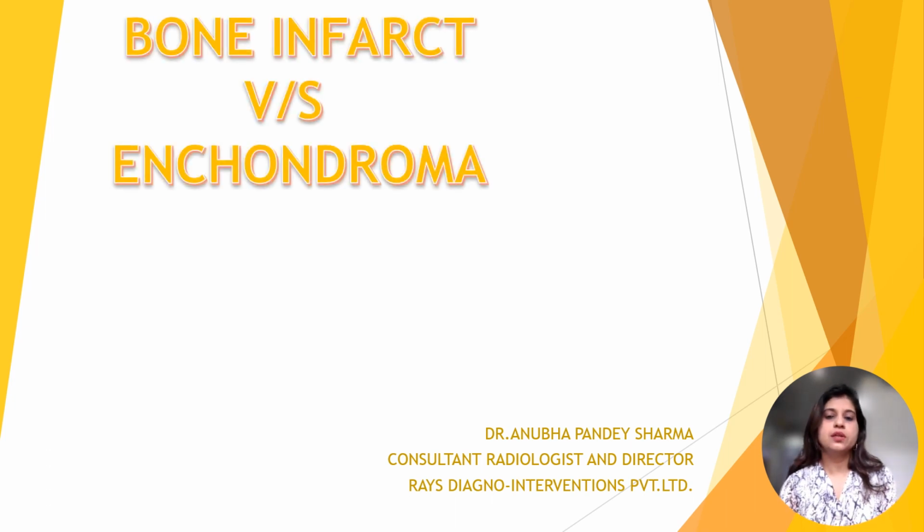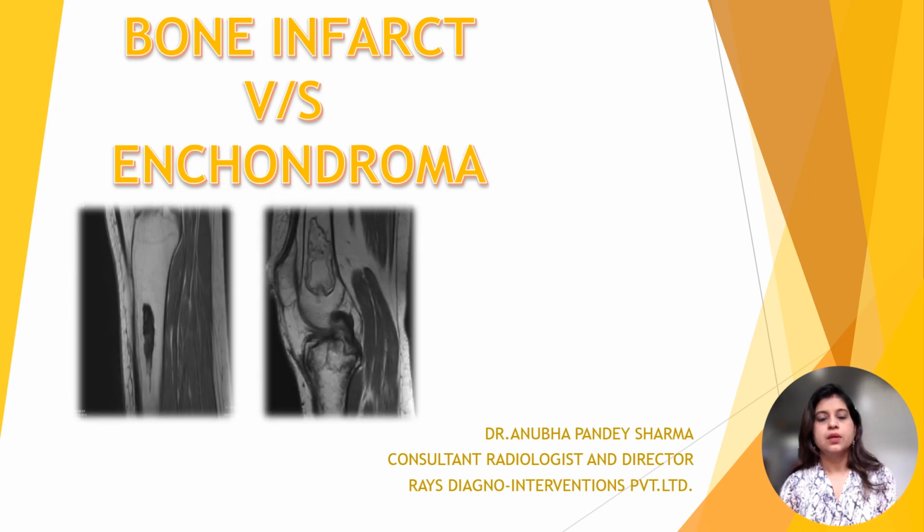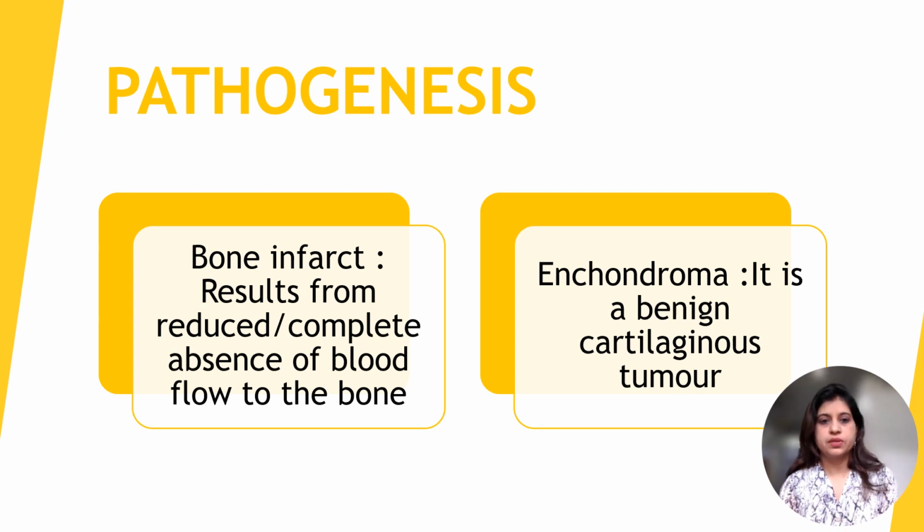Today I am going to share a presentation on a very confusing topic, that is bone infarct versus enchondroma. The pathogenesis of bone infarct and enchondroma is very different. Bone infarct results from reduced or complete absence of the blood flow to the bone, and enchondroma is a benign cartilaginous tumor.